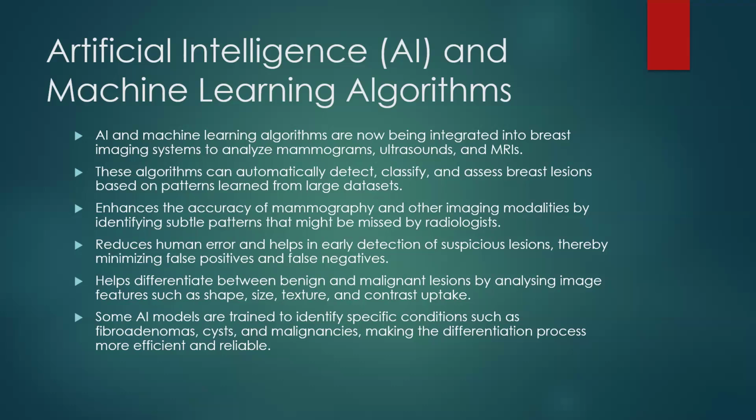In Sudan we have a new experience being done by Engineer Mohamed Abdalla Nasr. The program is called Milad. It's an AI-generated program that reads, based on a large database or data set of information, which enables the program to detect the masses and classify them into benign, malignant, or borderline. It is a very important breakthrough that is under development now.